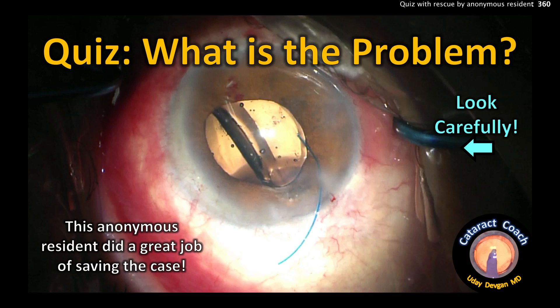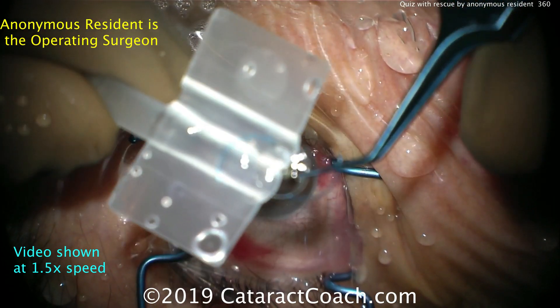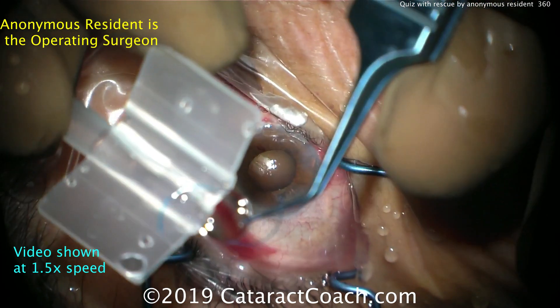CataractCoach.com quiz: what's the problem? Look carefully at this picture. This is an anonymous resident case. The patient has had a capsule rupture, so we're going to plan on putting in a sulcus IOL. There's a three-piece acrylic lens being loaded into the injector.